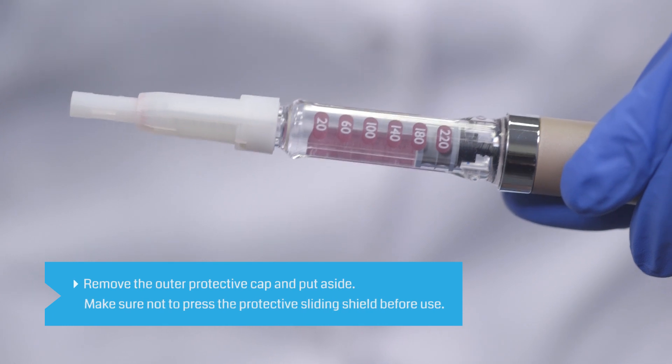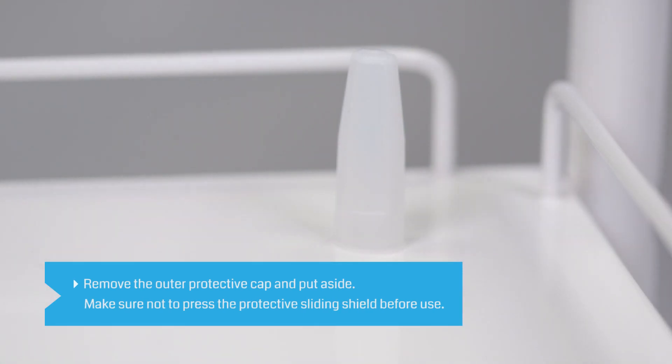Remove the outer protective cap from the needle and put it aside. Make sure that you do not press the protective sliding shield before use.